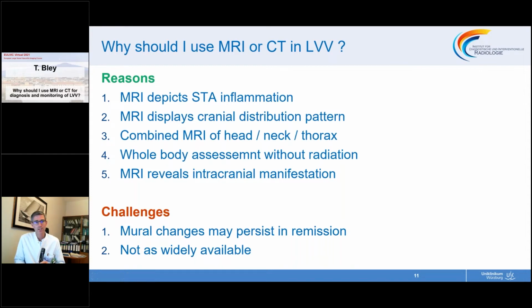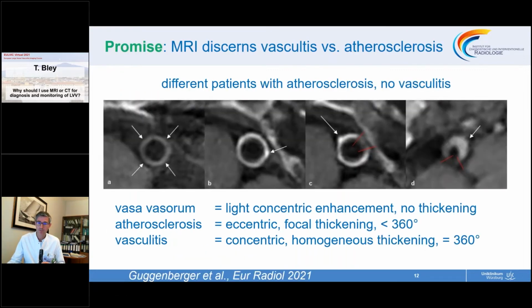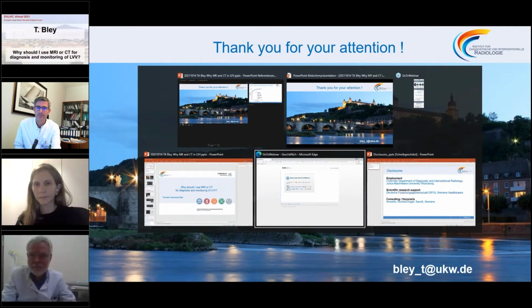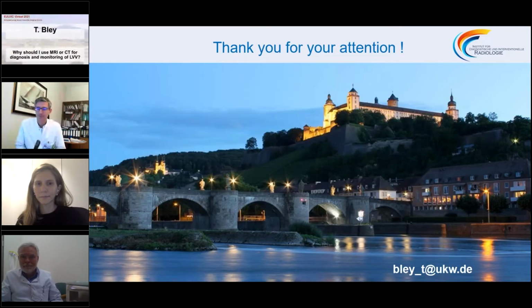MRI may be used to reveal intracranial manifestations and does have severe challenges, like other imaging techniques as well, to depict mural changes despite clinical remission in the follow-up, and it may not be as widely available. Thank you very much for your attention, and this is for discussion.